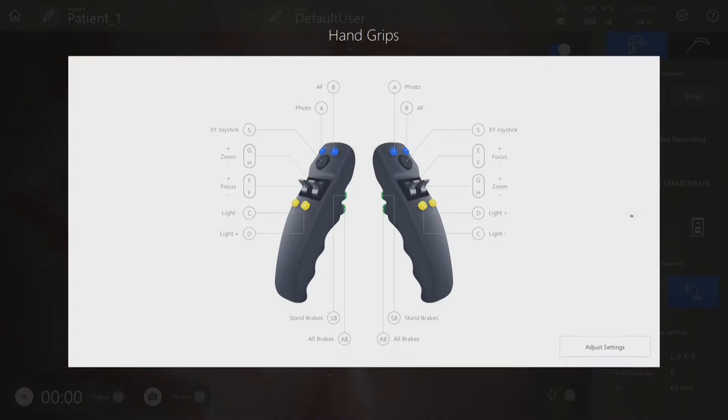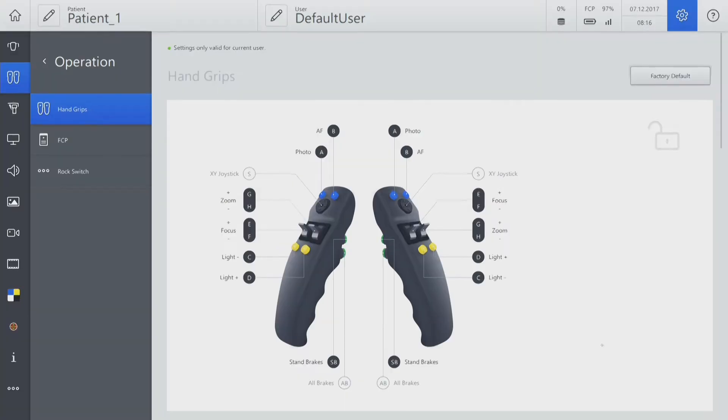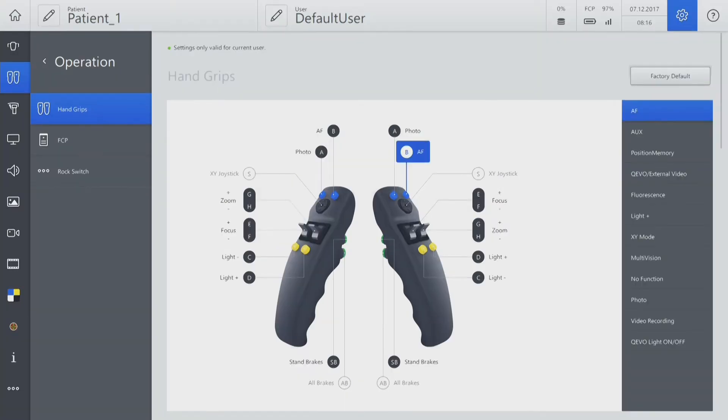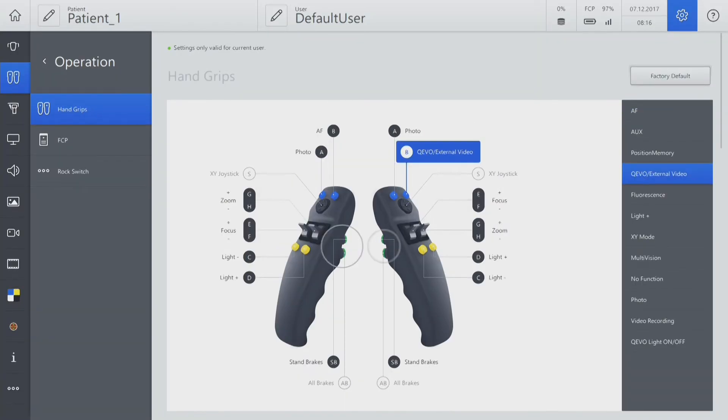You can check the default settings of the handgrip via the user interface. Remember that the lower green buttons cannot be reprogrammed.